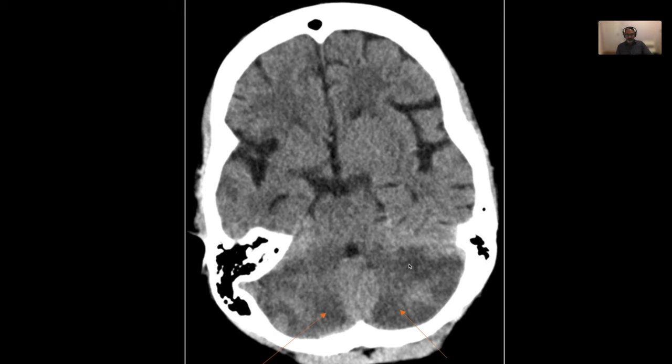What is this? Oh yeah, I got it. This is an infarct in this area. Now I got myself confused also, but it's actually not occipital, it's lower down. So what would be in the posterior area if it's not occipital? The cerebellum. So my question really was, from here, that it is a cerebellar stroke, but what artery is responsible for a cerebellar stroke?